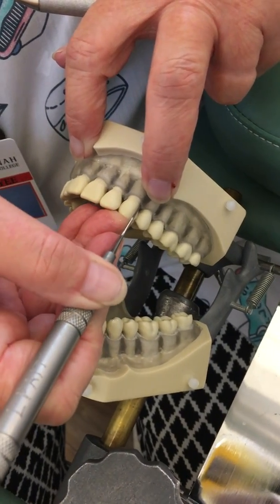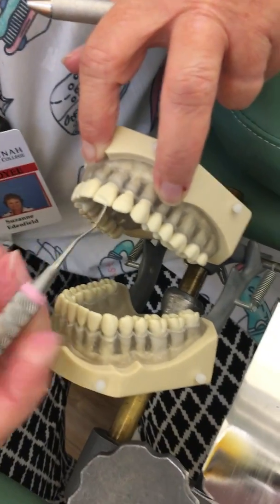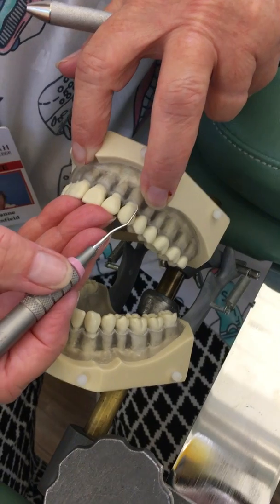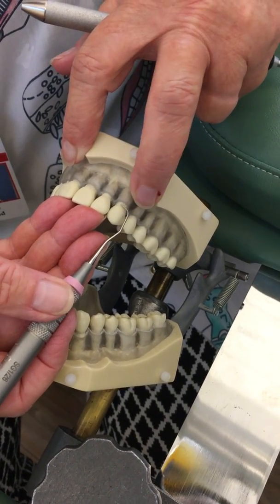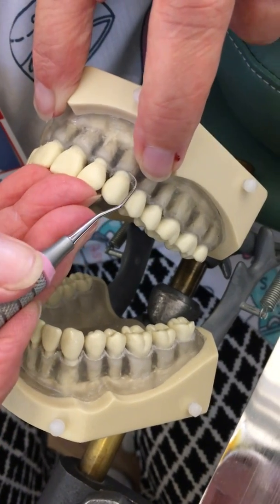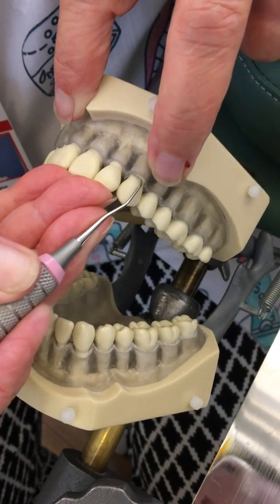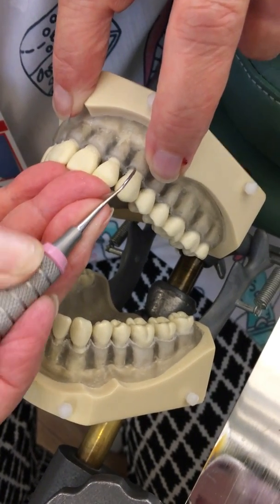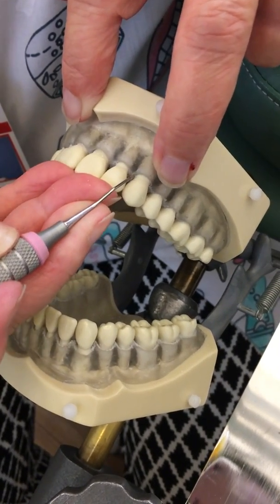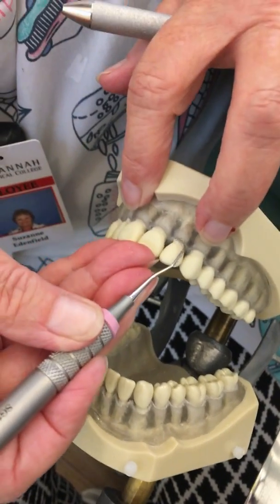I went one way and now I'm going to come back with the opposite end. I'll place my fulcrum on the tooth next door — I know I've got the correct end because I see the back of the instrument, not the face. I go closed and open, maintaining open as I move around the tooth, rolling that terminal third of the working end into the tooth with every stroke.